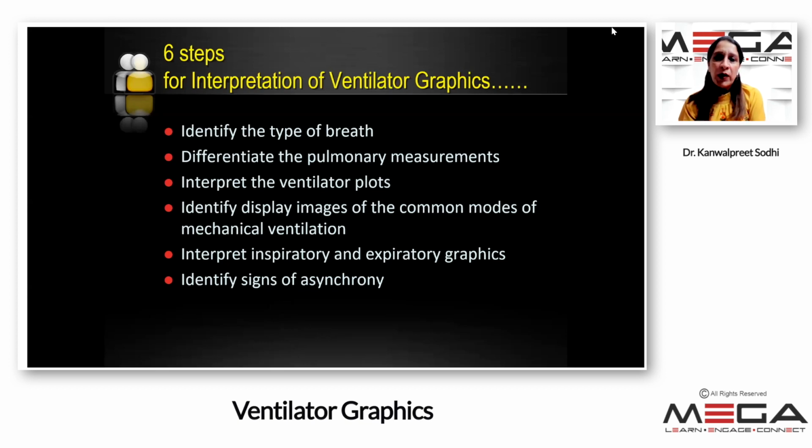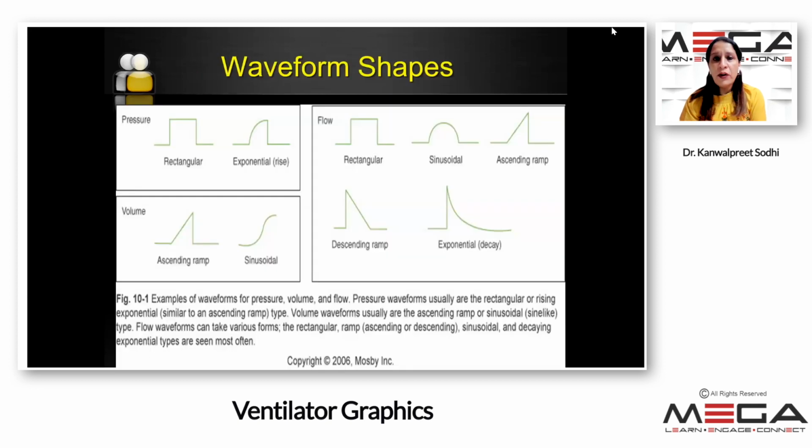But these are very theoretical things, actually. What I want all of you to learn in these next 20 minutes is what are the basics of ventilator graphics, how we are going to deal with them standing at the bedside of the patient, and how we can improve the management of the patients using these graphics.